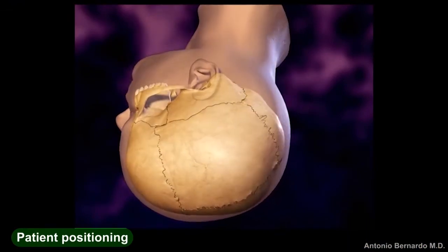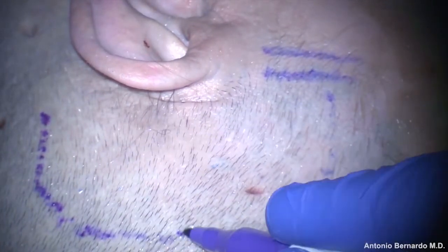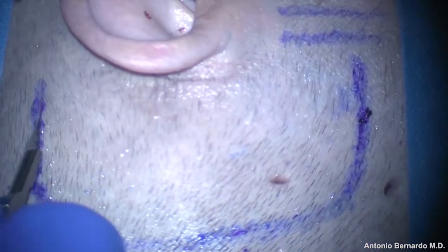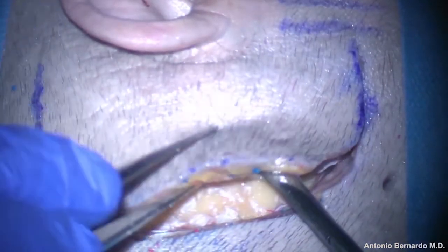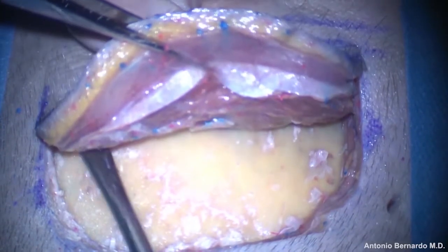The patient is positioned in a 90-degree lateral as in a standard subtemporal approach. The skin incision could be a semicircular incision based on the external acoustic canal, or a straight incision, or a lazy S incision anterior and superior to the tragus. The skin flap is elevated and reflected inferiorly.